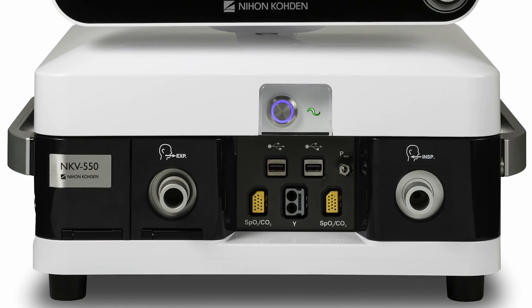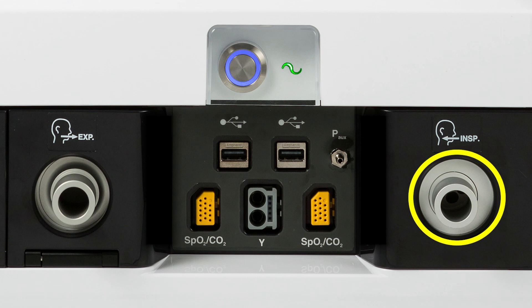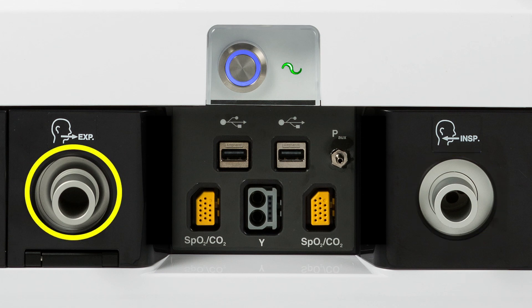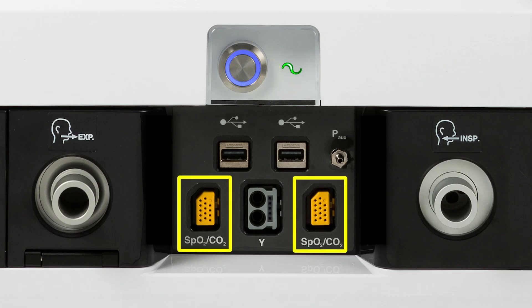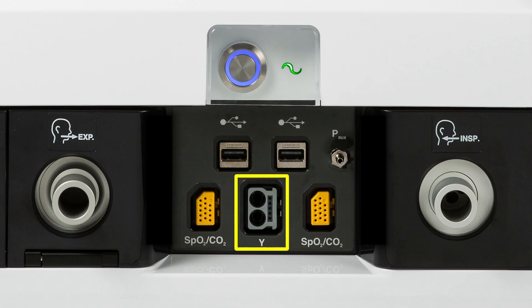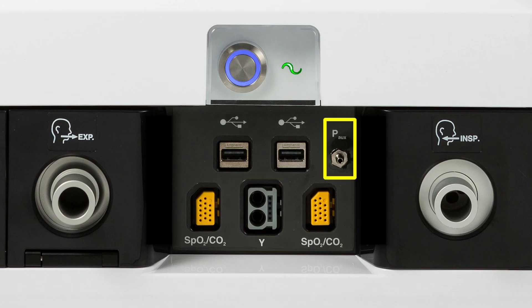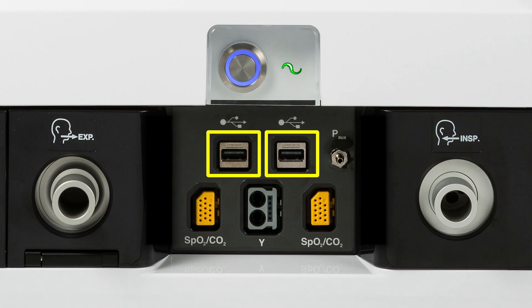On the front of the breath delivery unit is the inspiratory port, the expiratory port, the power on/off button, AC power indicator, two connectors for the Nihon Kohden CO2 and SpO2 sensors, the neonatal on-airway flow sensor, the auxiliary pressure sensor port, and two USB ports that are used for powering the Aerogen nebulizer, downloading of data such as event logs, trends, or screenshots, and also for upgrading software.